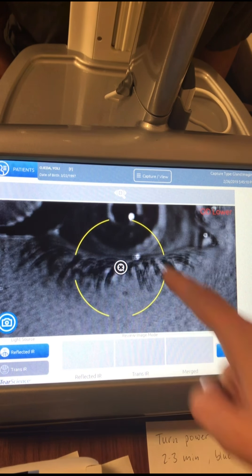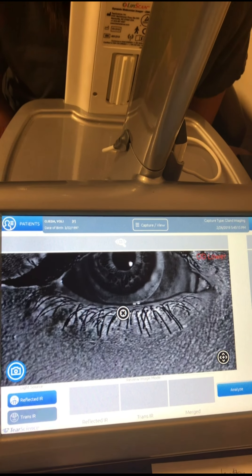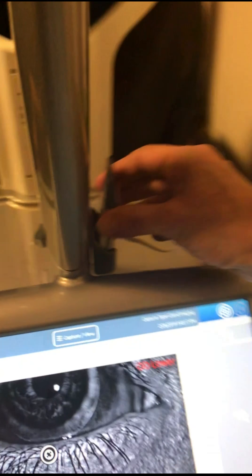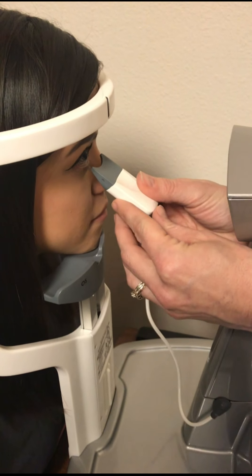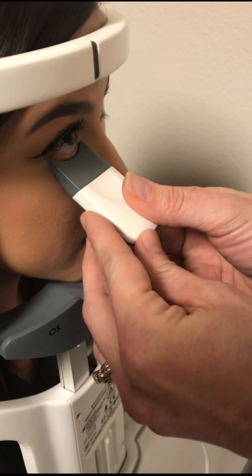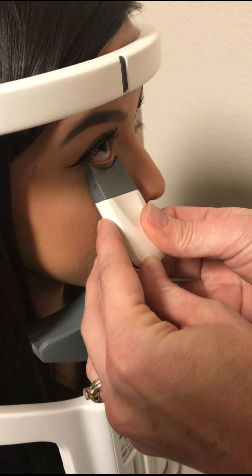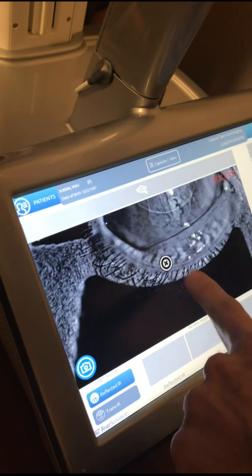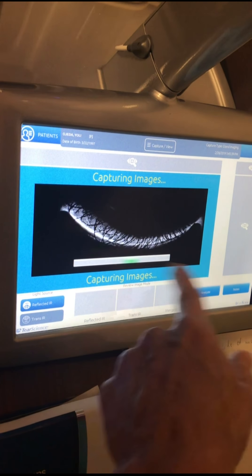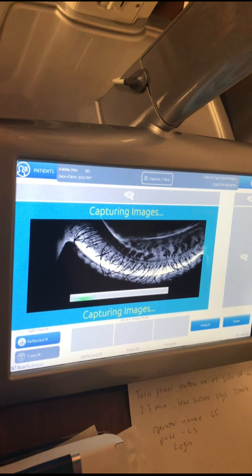To line you up I have to hit that button or that lid right there. It'll get in place. Hit the center button and the yellow will come up to focus. Once the yellow disappears you're ready to take your picture. Now you tell your patient to look all the way up at the screen. You grab your little handheld part here, touch both corners to both corners of her eye and flip the lid as much as you can. It might take a few tries but you want to get as much of it flipped as you can from the nose to the ear. Once you get that, you look on your screen and it's flipped and it's ready. So hit the capture button right there and now it's capturing. You don't want to have all that white down there so you push in and up if you want to get rid of that.